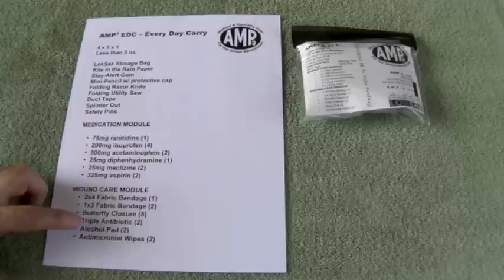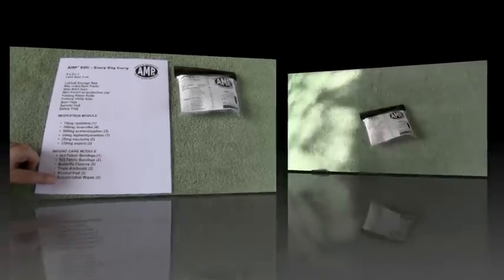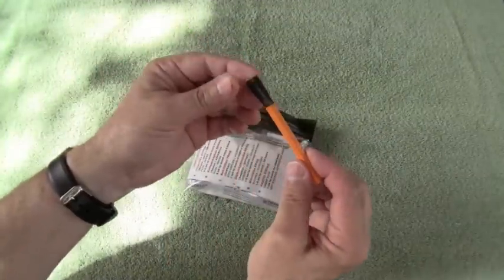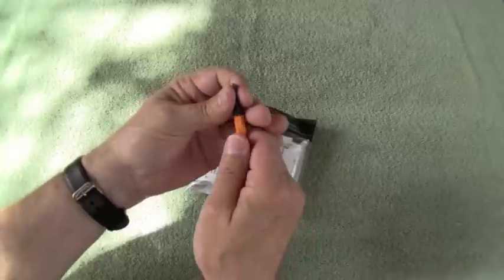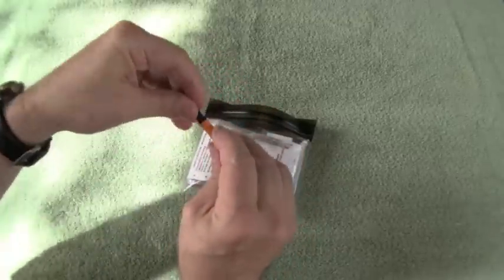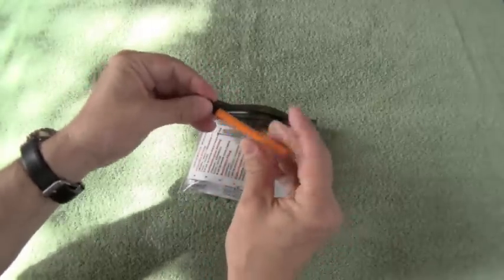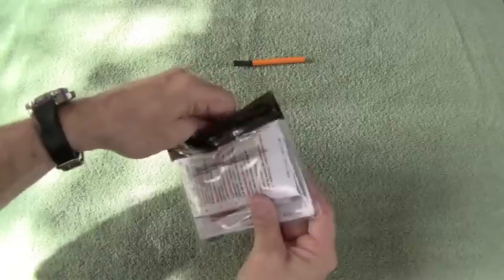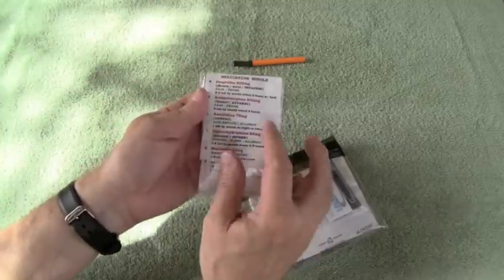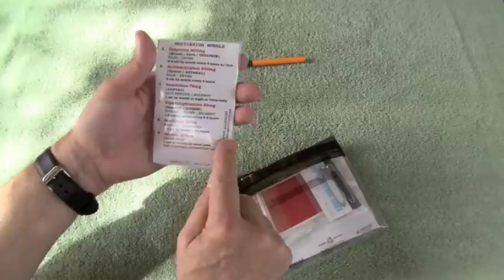In addition, you'll have a medication module that includes Zantac, ibuprofen, Tylenol, Benadryl, Meclizine, and aspirin, plus a small wound care module that includes fabric bandages, butterfly closures, antibiotic ointment, alcohol pads, and antimicrobial wipes. Here's the pencil with the small protective tip — it keeps the bag from being punctured. It goes on very easily by just wiggling the pencil and it's secure.